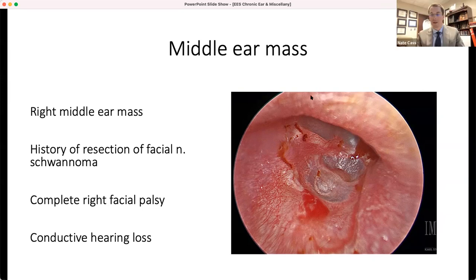The other thing, I think that sometimes you end up using some of those cup forceps because you've given up a lot of your counter tension with the lack of suction. And so some of those dissecting instruments just don't work as well when you have no counter tension. And so I think that's why you're almost forced to use some of these instruments in ways they weren't really intended to be used initially, but people have really found ways to get around that lack of counter tension and try to mitigate the disadvantages of using an endoscope.